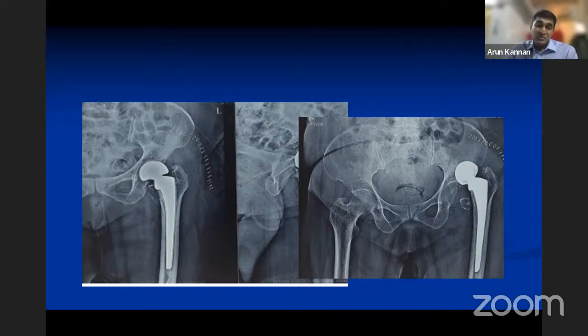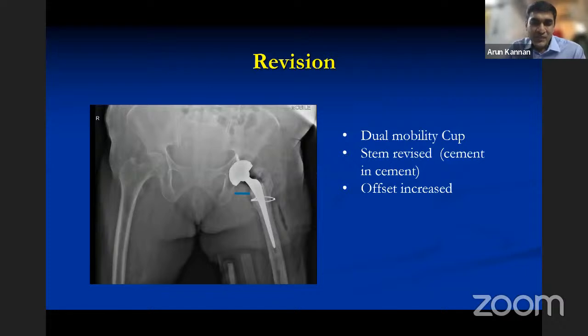Yeah, I got this patient at this stage. Another thing is that, compared to the other hip, the offset has also gone down. When I went in again, it was quite difficult to reduce it after increasing the offset. Again, it's a non-modular Hemi, so I think they just put it in wherever it was, and the reduced offset contributed to the dislocation again. When there is an offset issue, it is often due to external impingement. So that's what I was trying to show here.